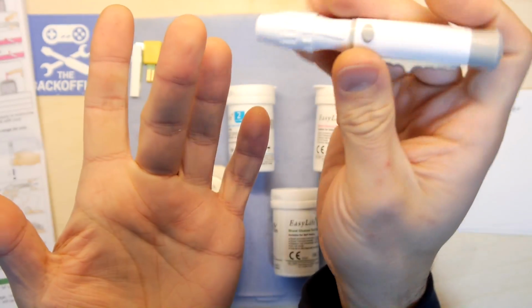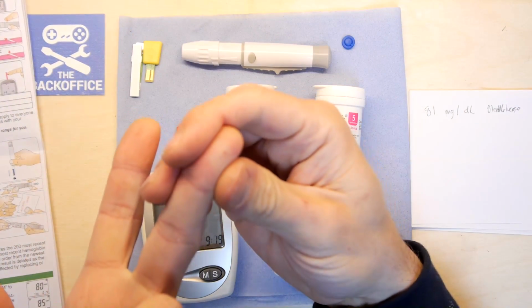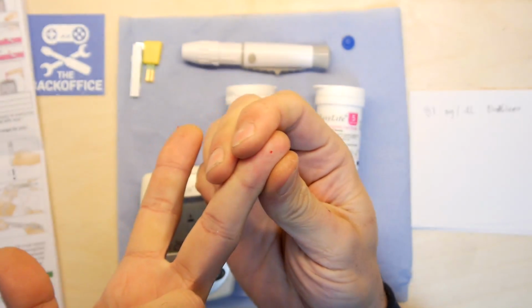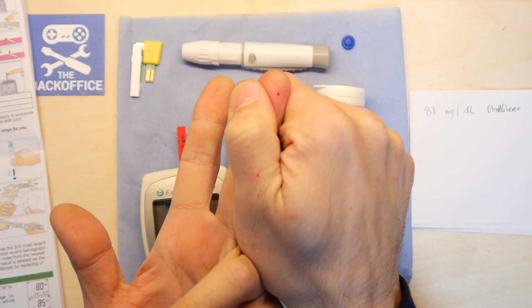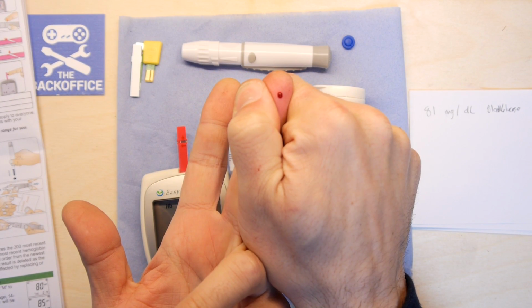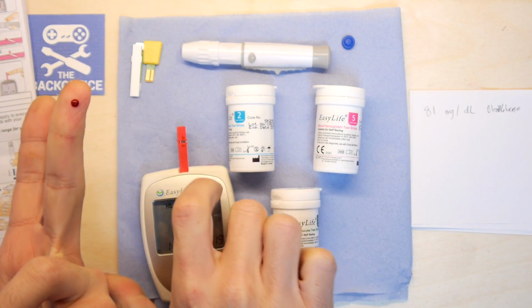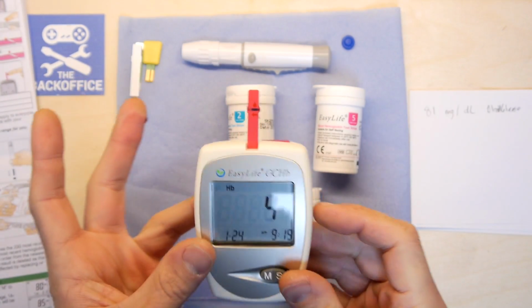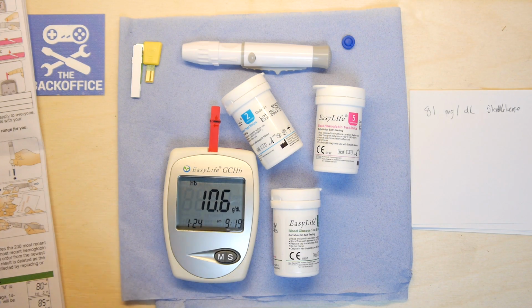Gonna go for same finger, different part, I think. Oh dearie me. So I think next time I do a cholesterol test, I'm gonna have to find a better place to prick. I mean, look at that. I'm just not getting what I need. Oh, that would have been amazing, that one, wouldn't it? Look at that. Sheesh. Suck it. 4, 3, this one's a quick one. 2, 1. 10.6.